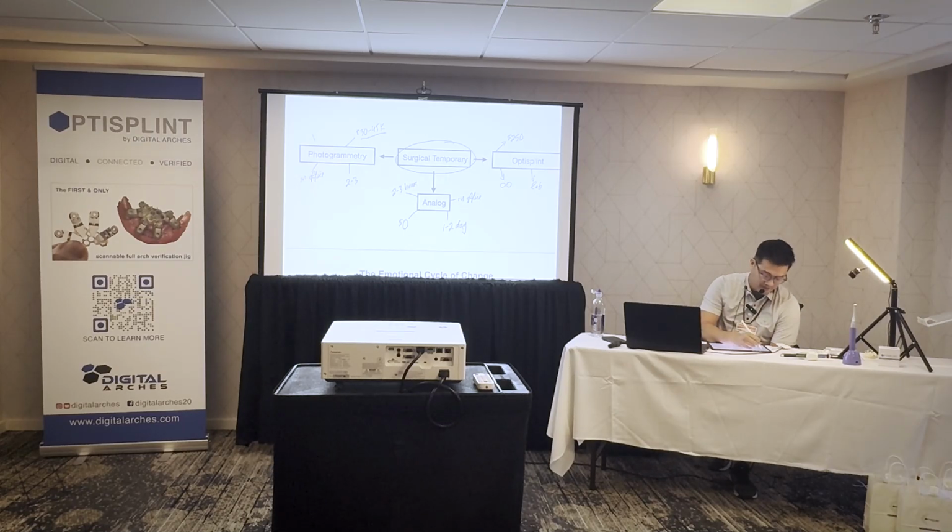Okay, so photogrammetry, it's kind of a timing issue, right? You can say, hey, surgeon, call me when the implants are going in, because I need to scan this case before the flap closes. The scan might have to go on with an open flap. So let's just call that an hour. Best case scenario, you get there, they're just putting on the multi-units, then you set it up and you scan. That's the best.